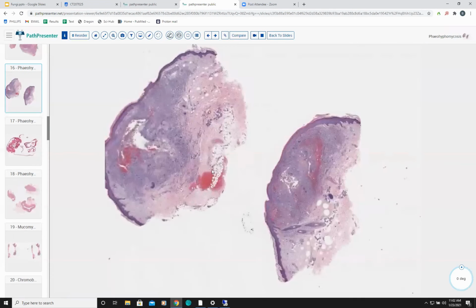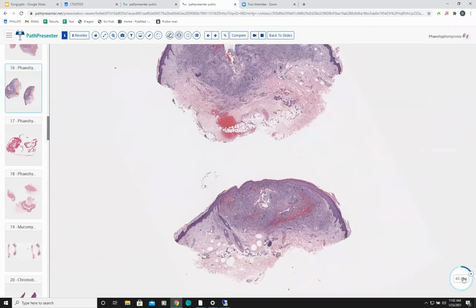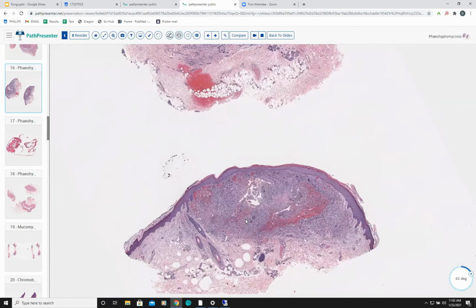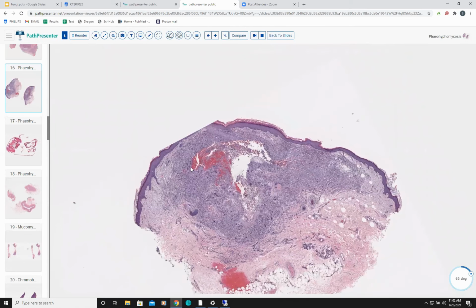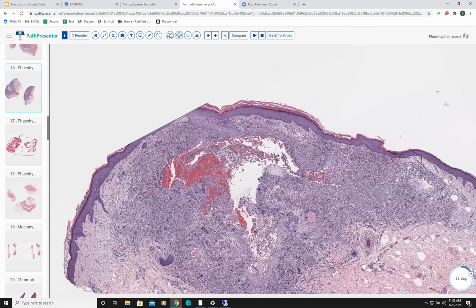Okay, I've got quite a few of these because these cases can easily be missed as ruptured cyst, response to a ruptured follicle, traumatic injury or something, and the fungus can be missed. So this looks like a dermal nodular lesion with a little bit of orthokeratosis and a bit of acanthosis.